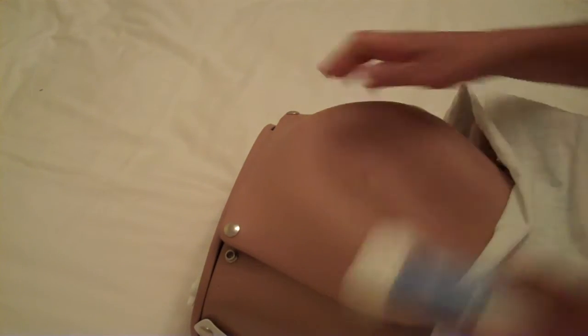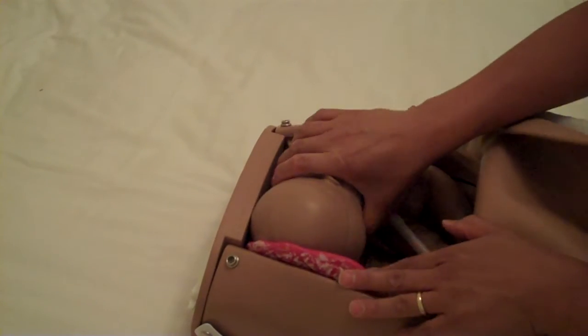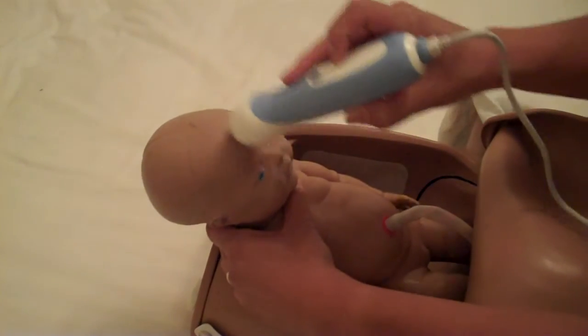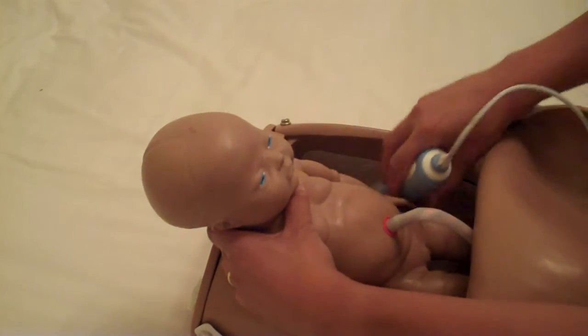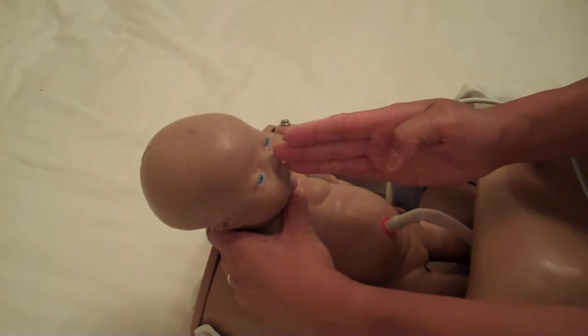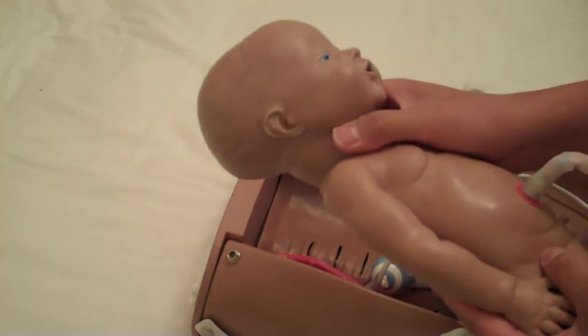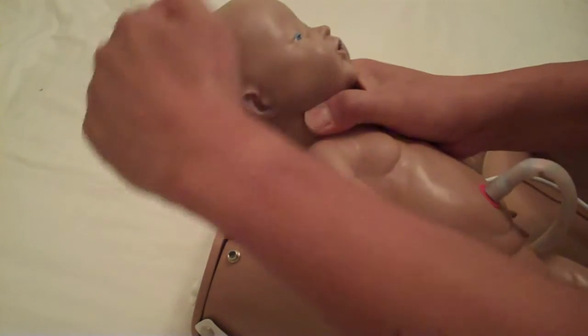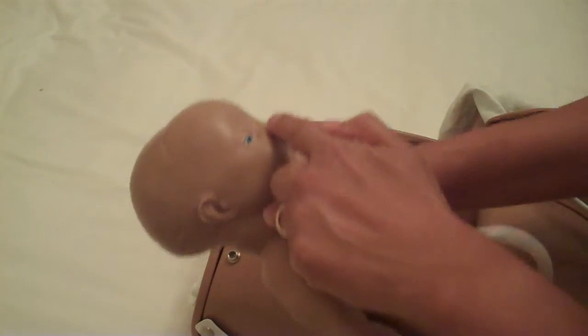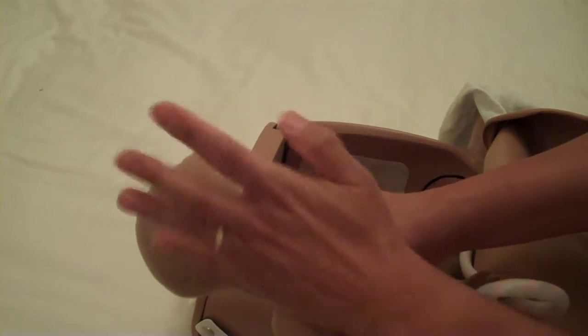You can think of the baby's head as like that. The baby's head kind of looks like a sphere. So let's say we're scanning the baby in this way, right here. So we're making a cut through there. What kind of a picture are we going to get? Well, the picture's going to look like this. You'll be able to see the outline, because you're cutting this way, of the nose, mouth, and all that, okay?